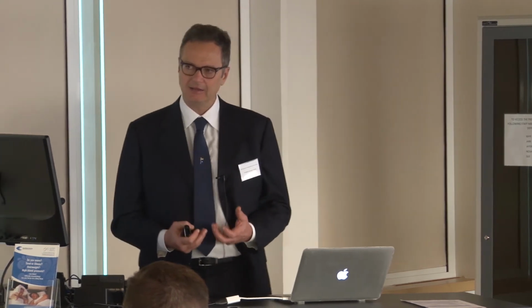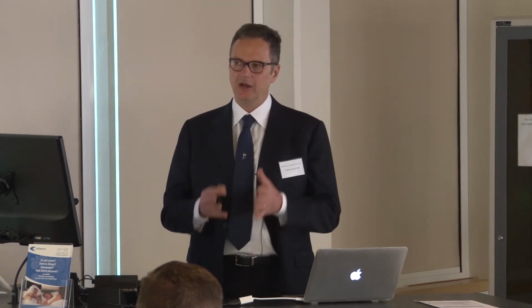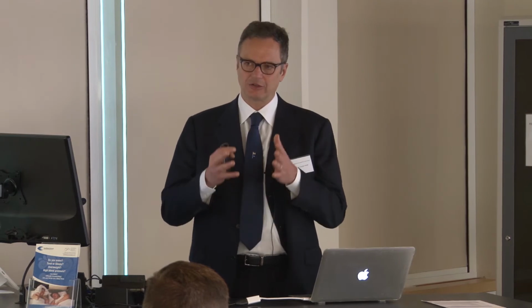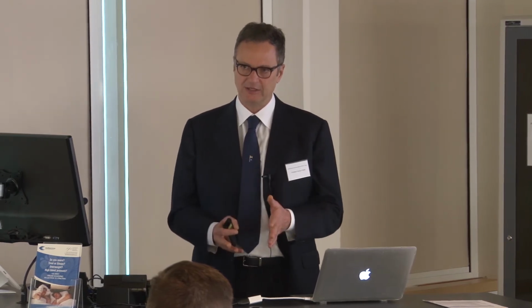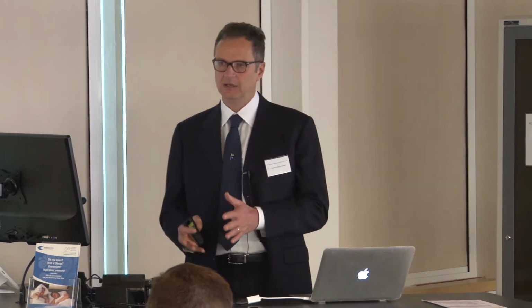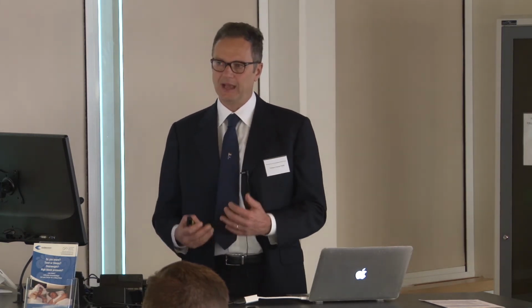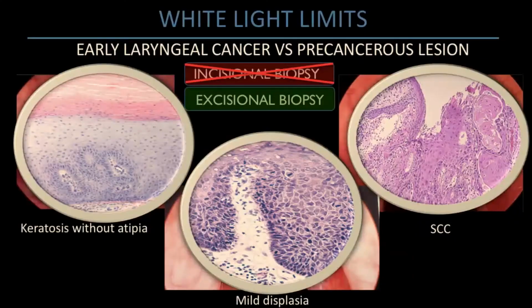And NBI helps you because you have to focalize on the vascularity and not only on the macroscopic appearance of the lesion. Leukoplakia and erythroplakia are clinical definitions, but they don't help you understand what is behind them.